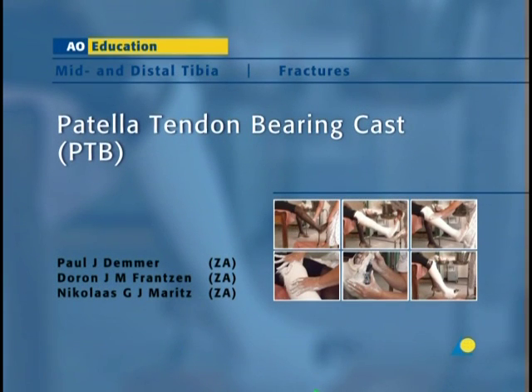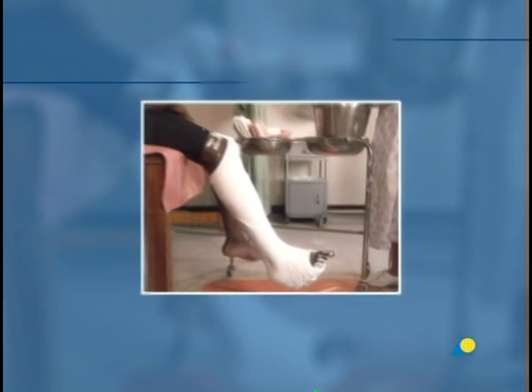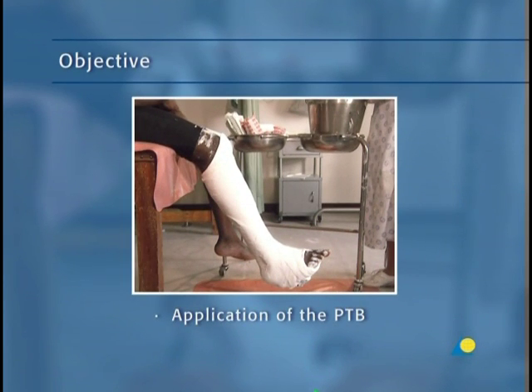The Patella Tendon Bearing Cast, or PTB, is usually applied as the last stage of treatment for tibial fractures. The pressure applied to the fracture site as the patient walks stimulates bone growth. The PTB may also be used for rehabilitation of the knee for a patient whose leg has been immobilized by a long leg cast. In this presentation, the application of the PTB will be demonstrated. The objective is to show the application of the PTB, a plaster cast that will stabilize the fracture while stimulating bone growth.